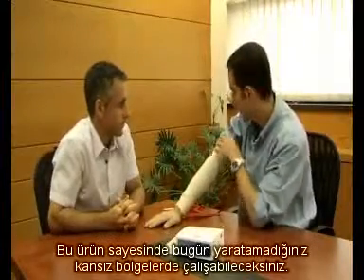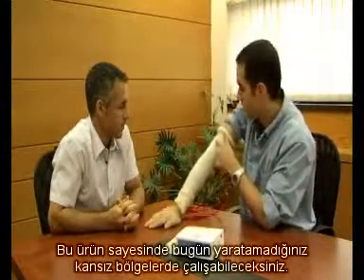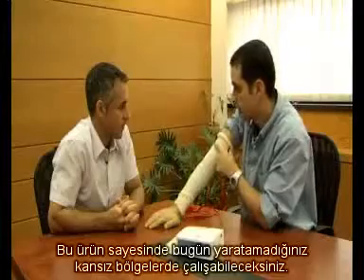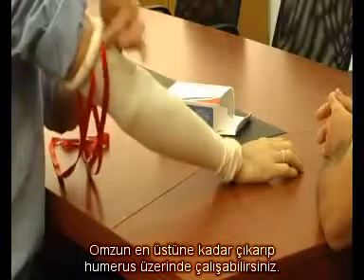Before I take this off, you can see that thanks to its sterility, you can work in a bloodless environment on places that you cannot work today. You can take it all the way up to the shoulder, so you can work on the humerus.